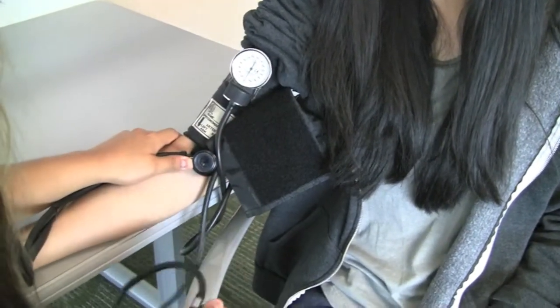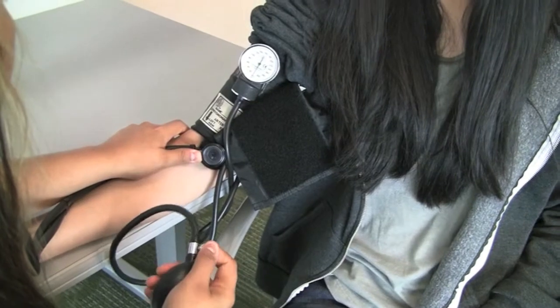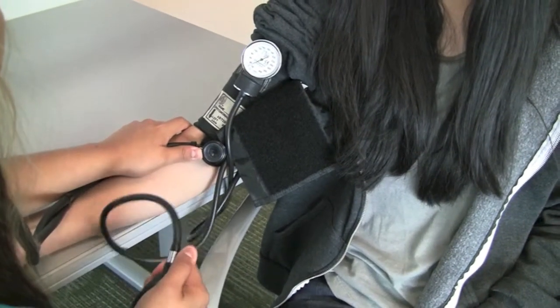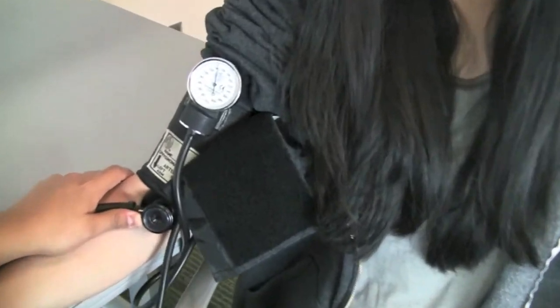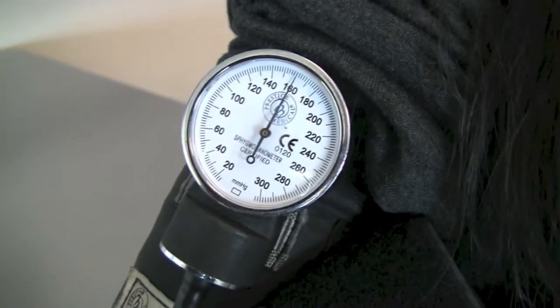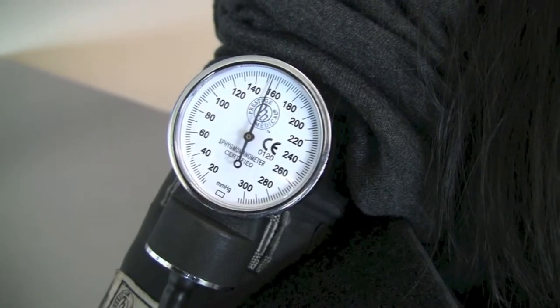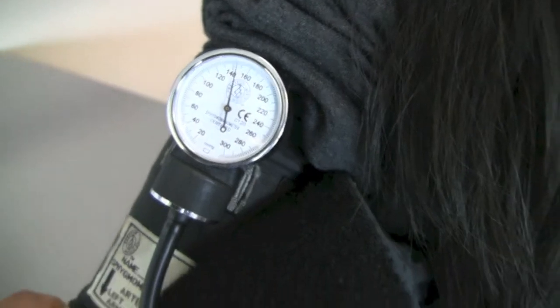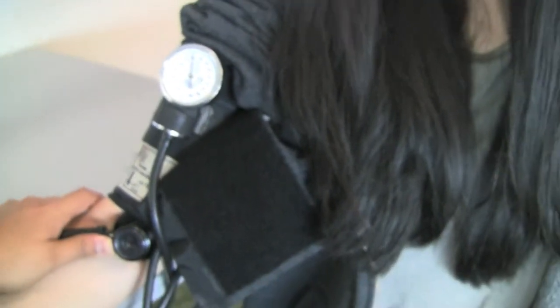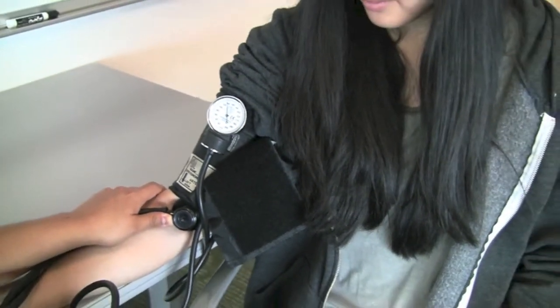Begin inflating the blood pressure cuff by continually squeezing the cuff bulb until the gauge reads 160–180 mmHg for females and 180–200 mmHg for males. If you still hear a pulse after inflation, continue inflating the cuff until no pulse is heard. Then slowly deflate the blood pressure cuff at a rate of 2–3 mmHg per second. Deflating more quickly than this can cause inaccurate measurements.